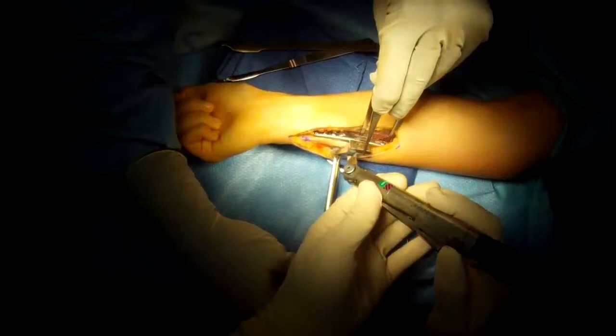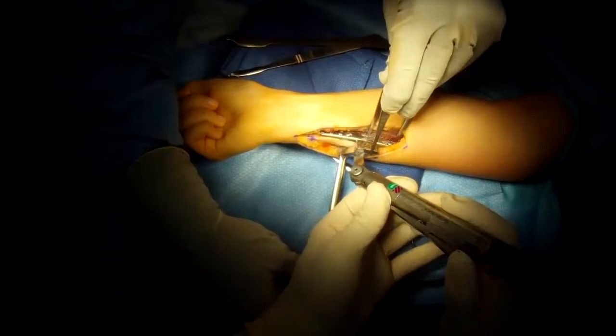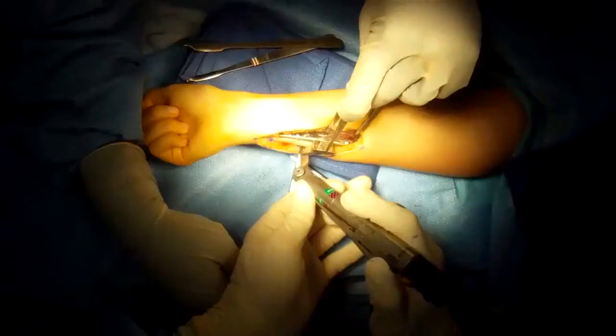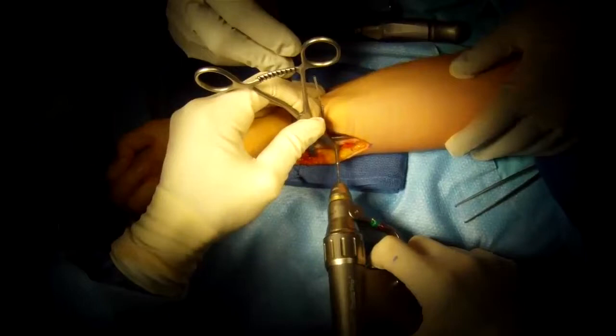Now we have a saw guide and we're making the first saw cut — this goes through the bone. This is a second saw guide; it looks just like the first but it's a few millimeters over, so we can take out a small wafer of bone.